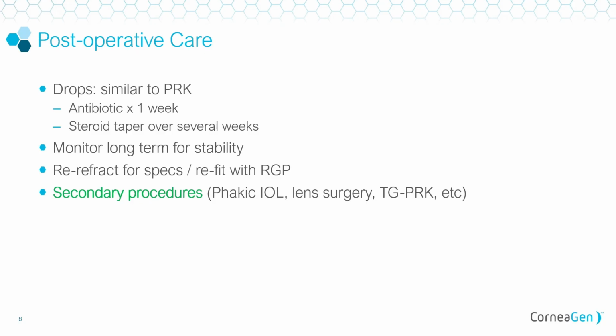Moderate to advanced, and pre-counseling, hey, you may still need this, but by the way, your RGP fits are going to be so much better after you have flattened the cornea. So much better. And so, yes, we have advanced technology, scleral lenses, right, to fit these crazy, wacky cones, but those are much more expensive than a hybrid lens, and they're out of the reach of some of the patient population that comes in with keratoconus, right?